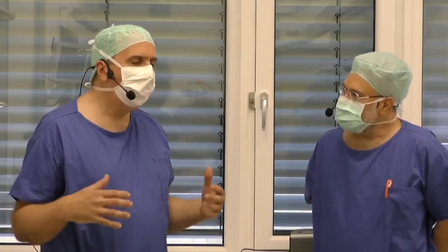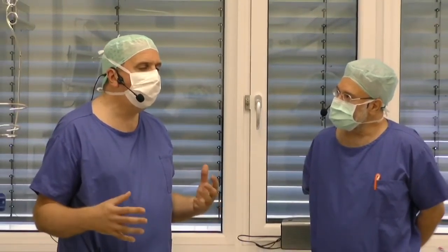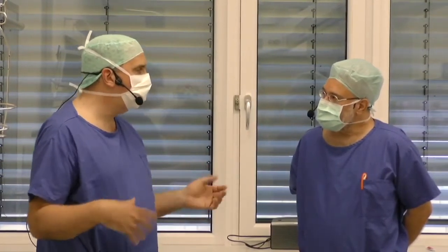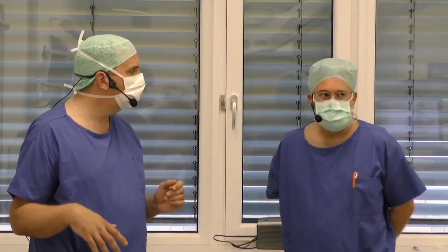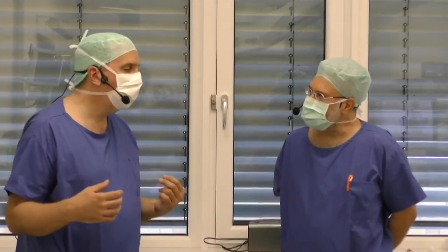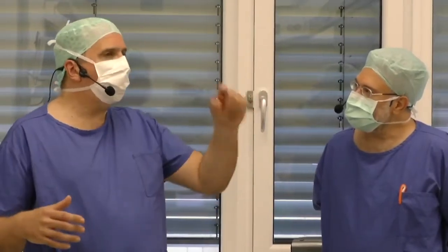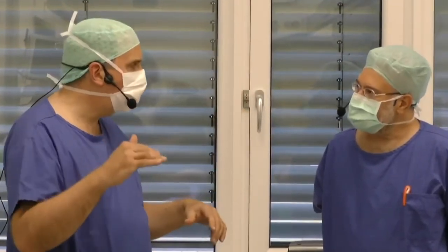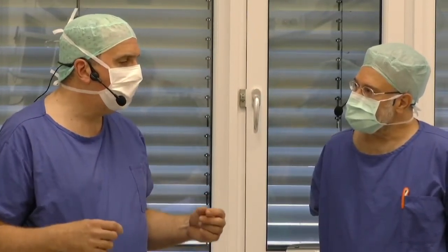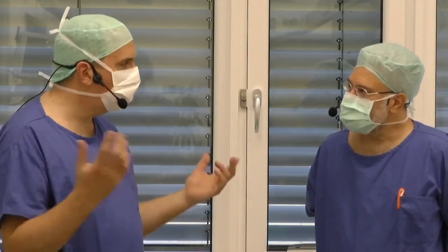Normally in, let's say, a LOCS N2 up to N3, you normally end up with a total energy given in the eye between 500 millijoules to 1 joule. Okay, and that's the energy indicated by the machine, the amount of energy actually emitted in the eye? No, this is the energy given in the eye. The energy measured by the machine is 8 folds higher, but it's measured inside the tube of the nano laser. Then the energy given in the eye is 8 folds lower.